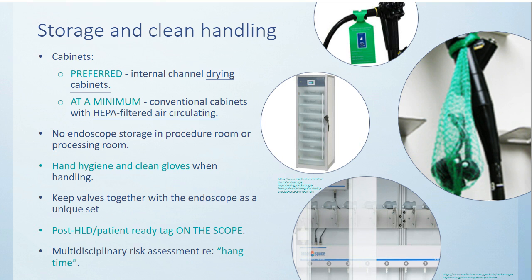We did keep the recommendations in to keep the valves together as a unique set, but we've given many more recommendations as to how you might be able to comply with that, because we did have a lot of questions and even some pushback on that recommendation. But it is important, if you're still using reusable valves, which not a lot of facilities are anymore, that you somehow have them traceable to the patient and the procedure. So more information in there on that. We do still recommend a distinct visual cue be placed on the endoscope in the storage cabinet so that anyone knows by looking at it that it has been processed and is patient ready. So however you choose to do that with a tag would be fine then.